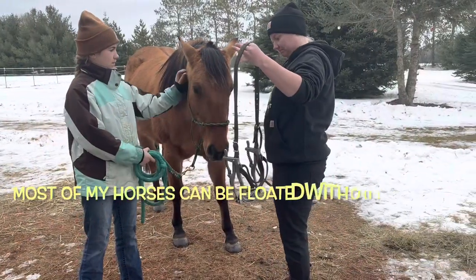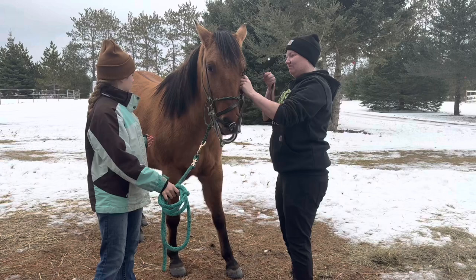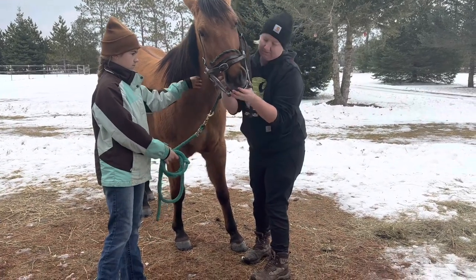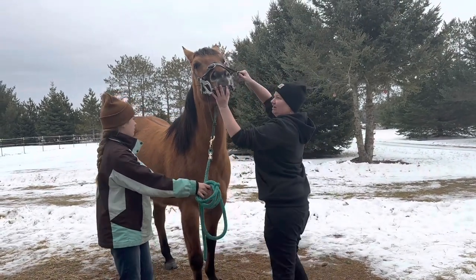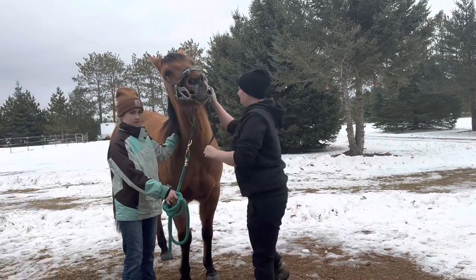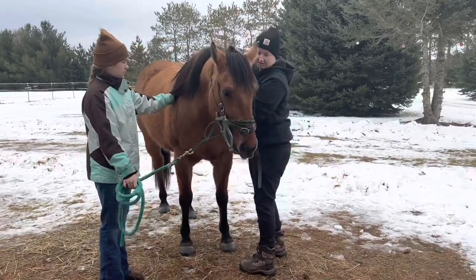Take a look at this. Okay. She's like a bridle. Should smell like other horses. Yeah, good girl. So these plates on the front here, they actually sit on her front teeth, her incisors, and because of that, it allows me to open up her mouth. So she's on there good. I always like to give them a chance to get used to it, and we just pet them, make sure they're comfortable. Her eyes are really soft, so she's pretty relaxed.